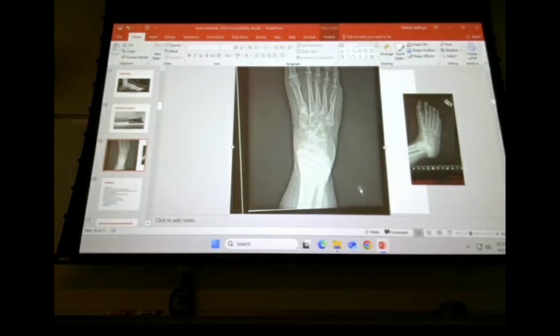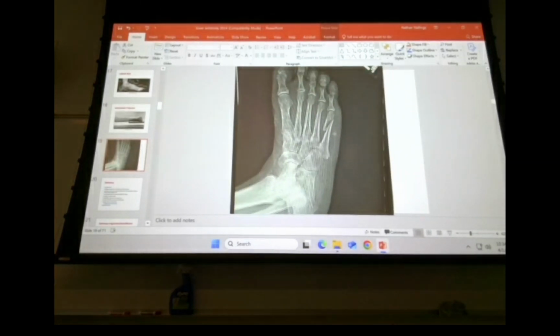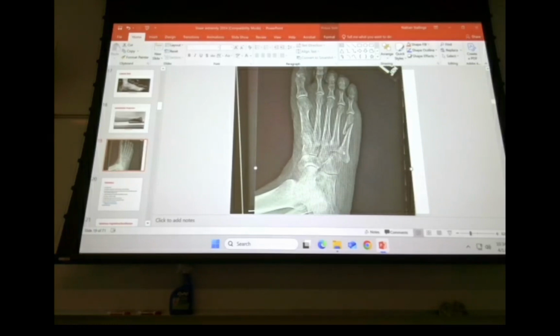I assume this is the same person. So you see what I mean? The lateral sometimes just doesn't give you the information that you need to see, as opposed to an oblique. Not to really criticize, but this was what I was talking about in guarding against just having the patient move their knee over. It's not very oblique, but it still highlights that fracture a little bit better. So sometimes that oblique is a better view than the lateral to visualize a fracture.